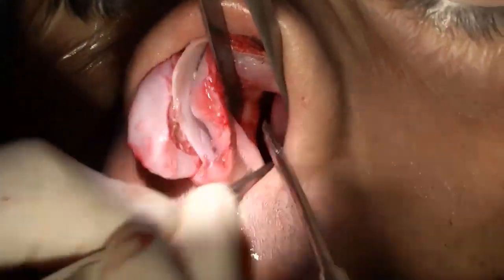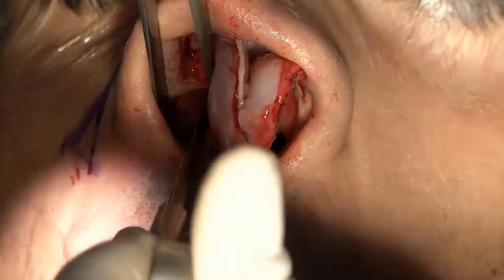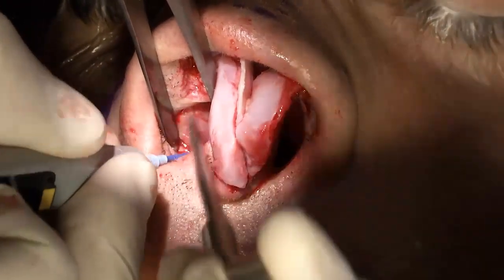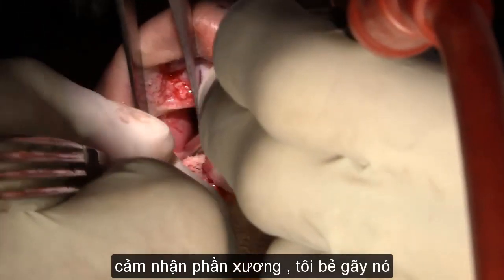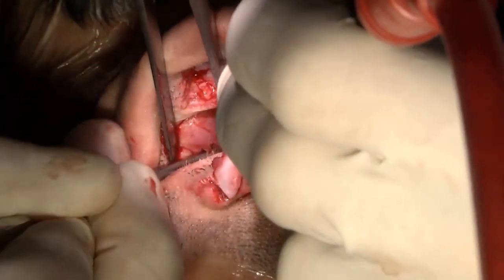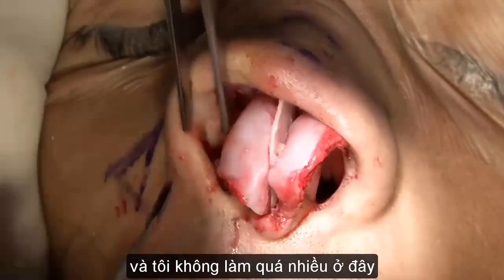I'll do the same on this side. Feel the bone. There it is. I broke it already. And I won't do much else with it, frankly. There it is.